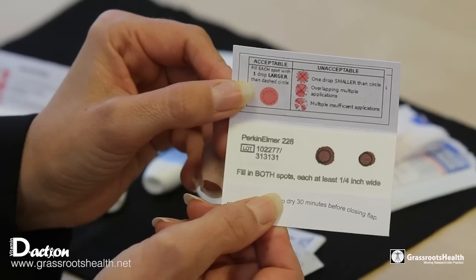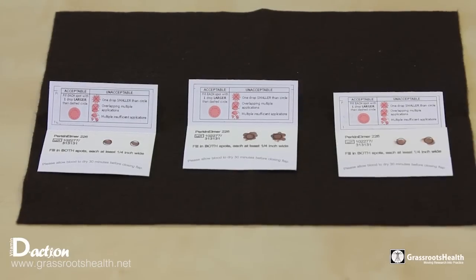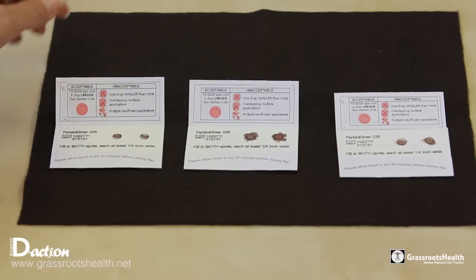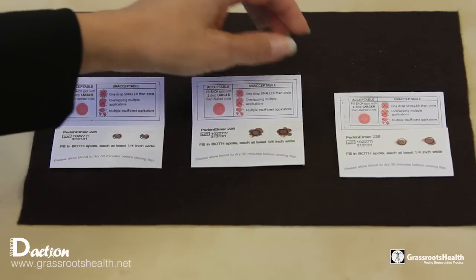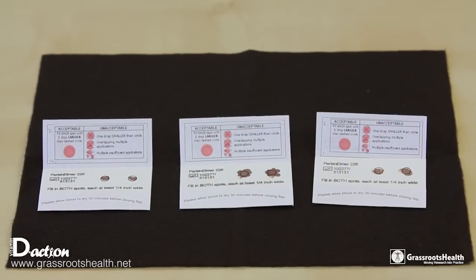Once it is dried, you will take a look at it, and at that point in time it should be somewhat brown. Here we want to show you an example of three blood spot cards that would be deemed unacceptable. The first one on your left does not have enough blood and the spots are too small. The middle one has overlapping drops, which would also be unacceptable by the lab. The third one — you have to look at the back to see that the blood didn't soak through. So all three of those conditions are things you want to avoid in creating your good blood spot card.